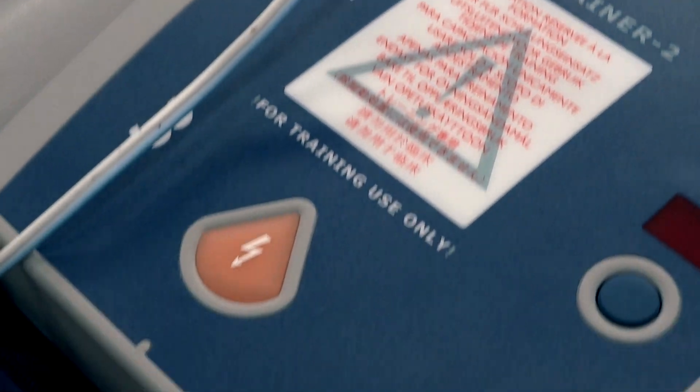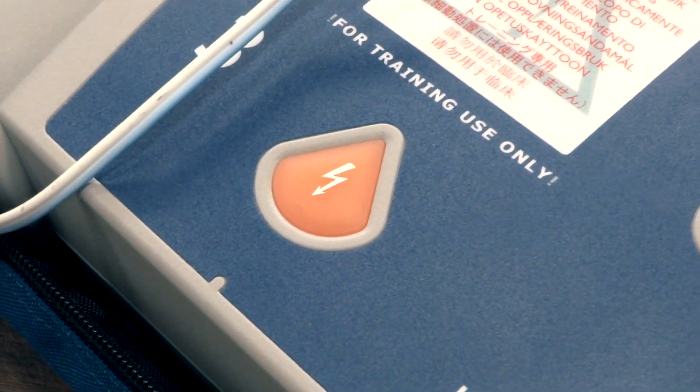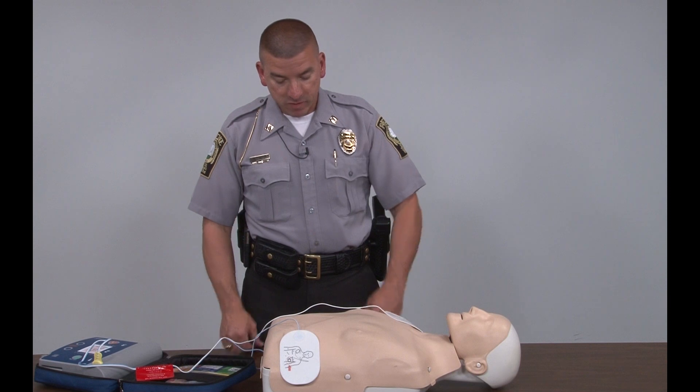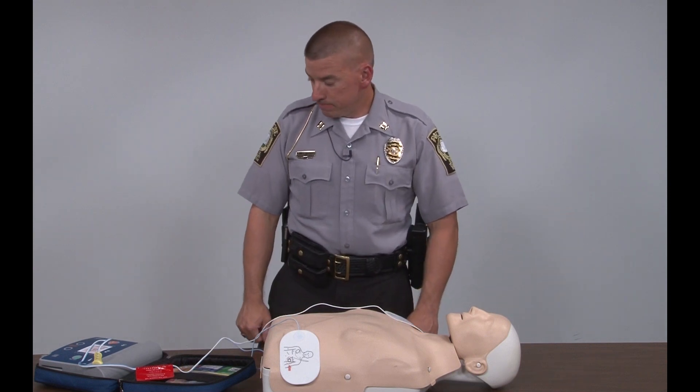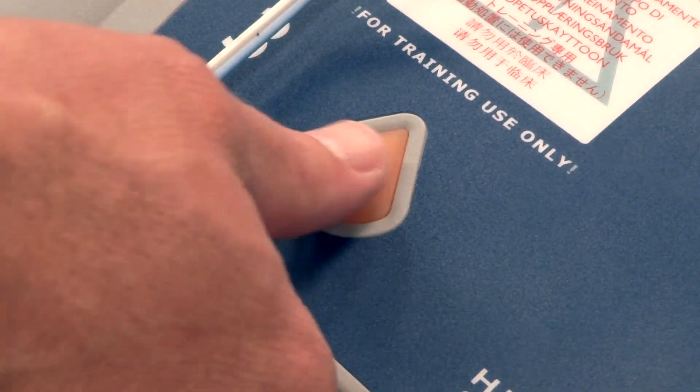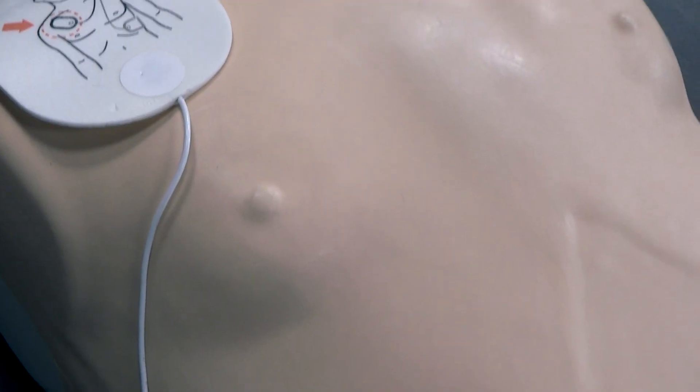Shock advised. The AED is charging. Stay clear of the patient — at this time I would tell everybody to stand clear and get ready to shock. Press the orange button now and I will deliver the shock. Shock delivered.